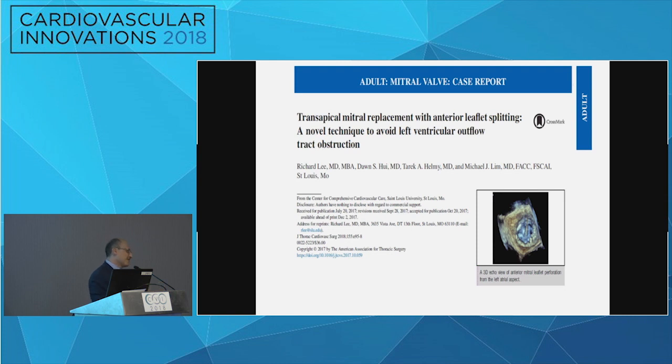I wouldn't go that far. You have a little bit of thought behind it, too. I actually share your concern about how long we are going to be doing this, because obviously the challenge in valve-in-MAC is not just LVOT obstruction. There is a high risk of perivalvular leak, and a high risk of embolization. Not all LVOT obstruction is created equal. There are some people who do well with LVOT obstruction.